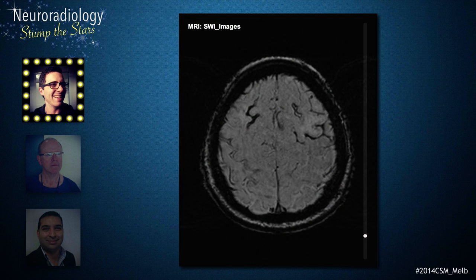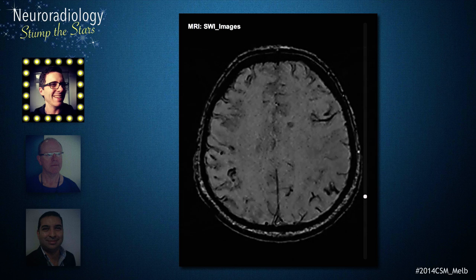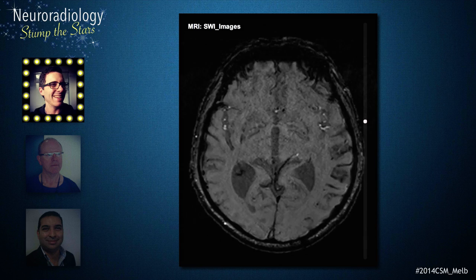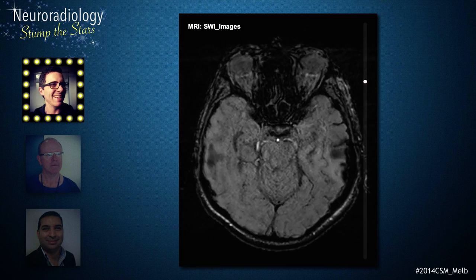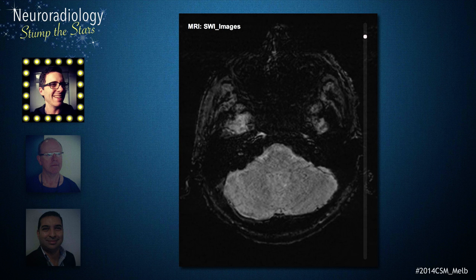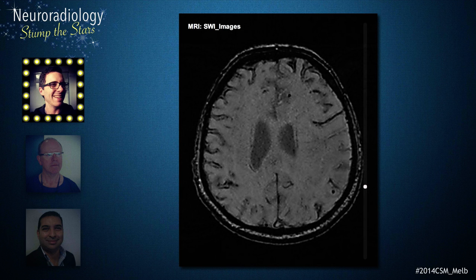The most striking abnormality is seen on susceptibility weighted imaging. There is extensive signal loss seen over the convexity of the cerebral hemispheres, outlining numerous sulci. The posterior fossa is spared from such change. In addition to superficial siderosis, there are numerous punctate regions of susceptibility-induced signal loss scattered peripherally within both cerebral hemispheres.